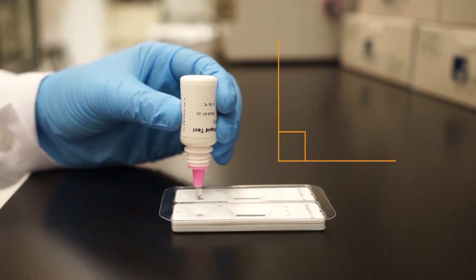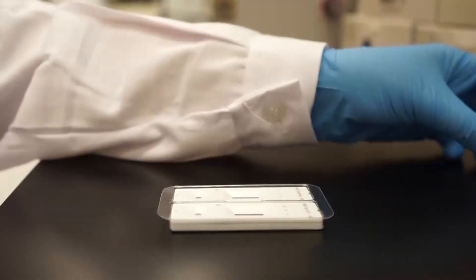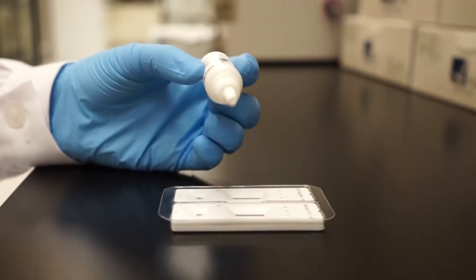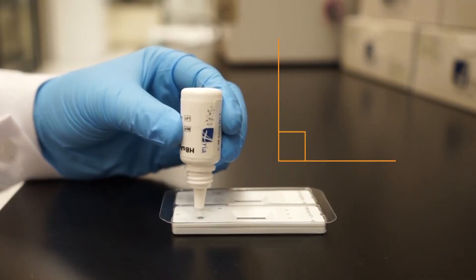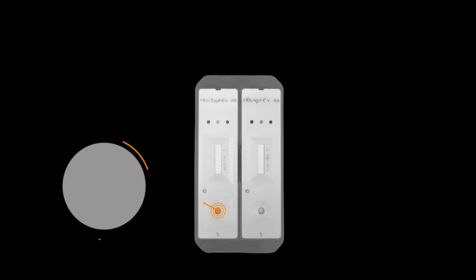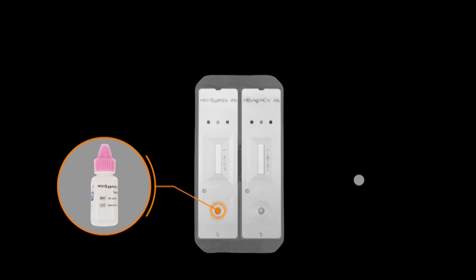Immediately add one drop of sample diluent into the center of each sample well with the bottle positioned vertically. The pink cap sample diluent is for the HIV syphilis cassette. The white cap sample diluent is for the HBV HCV cassette. Do not switch the sample diluents.